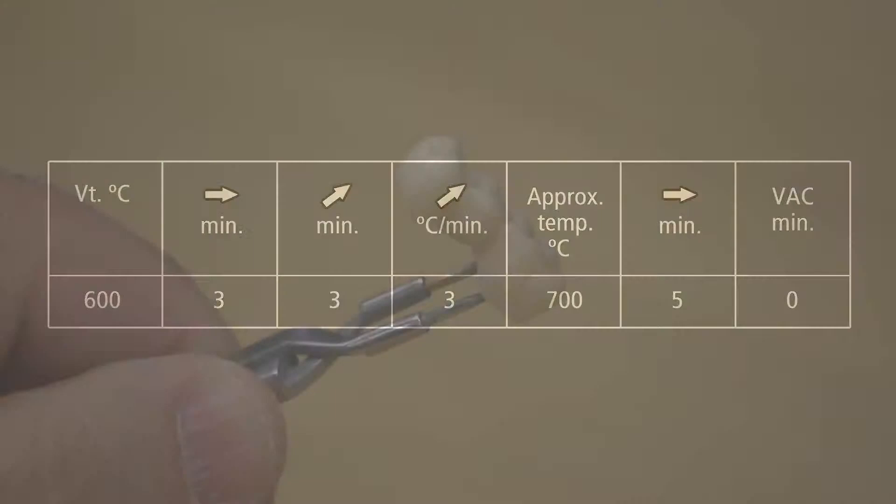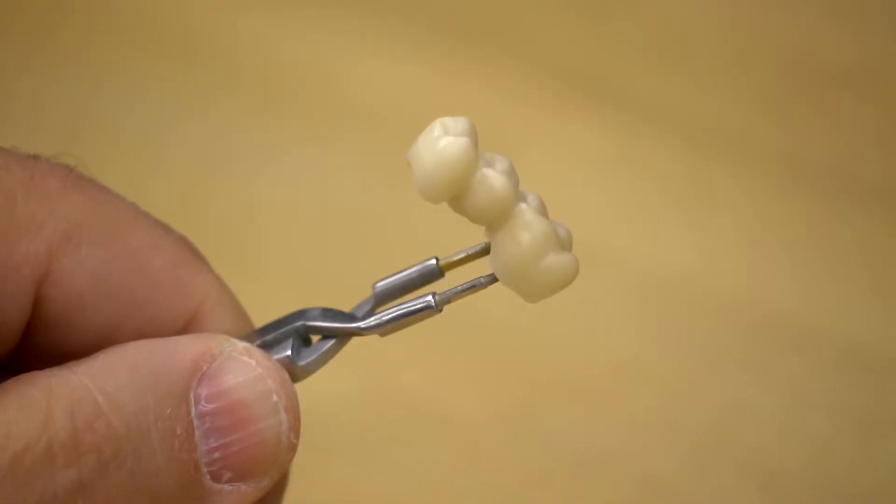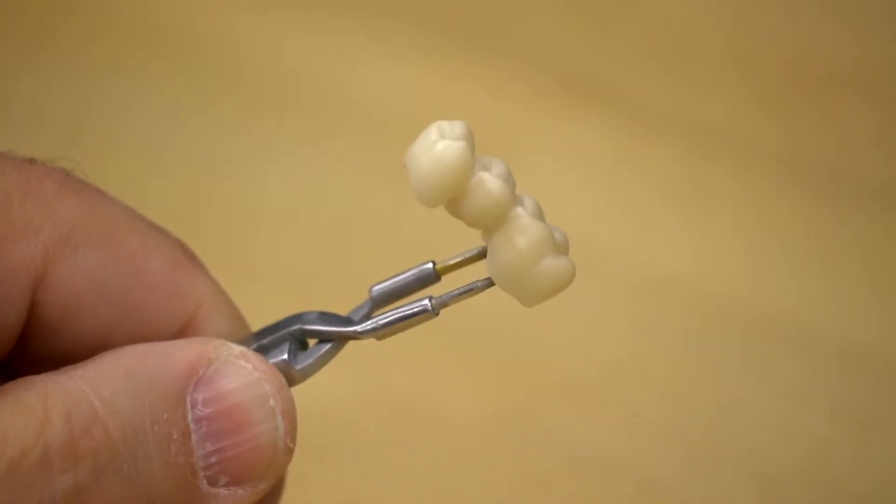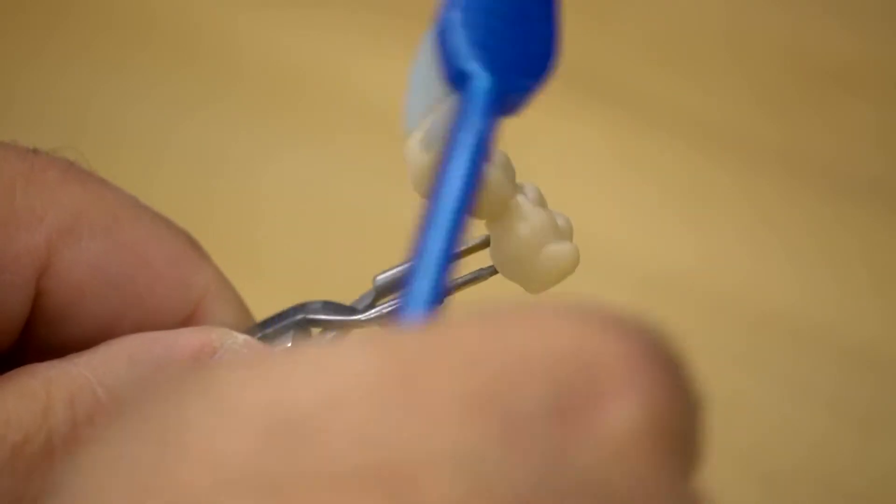Sirona has a unique coloring solution that is designed to provide proper color intensity in just five minutes. Clean the restoration lightly to make sure there is no loose dust on the unit.